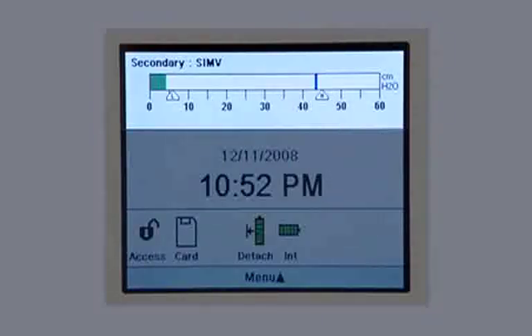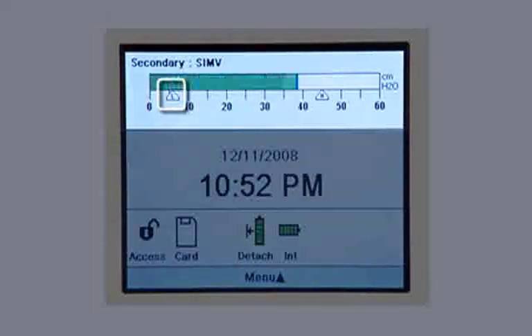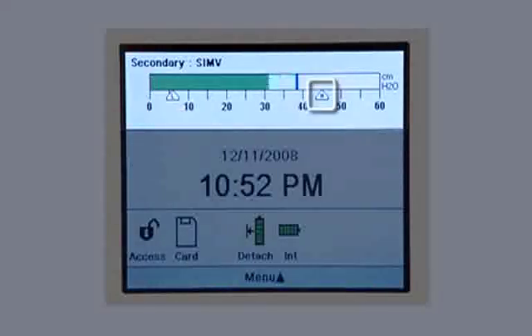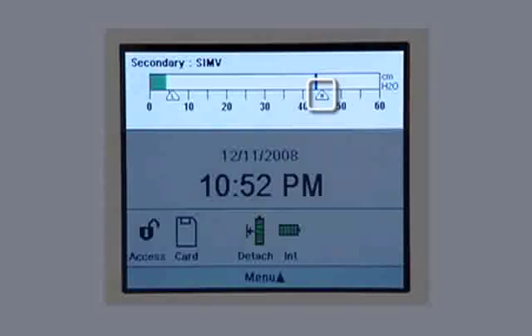If the volume mode is set, you'll see a tab with an L below the bar graph. If the patient pressure falls below this level, the low pressure alarm will sound. An H below the bar graph indicates the pressure which triggers a high pressure level alarm.